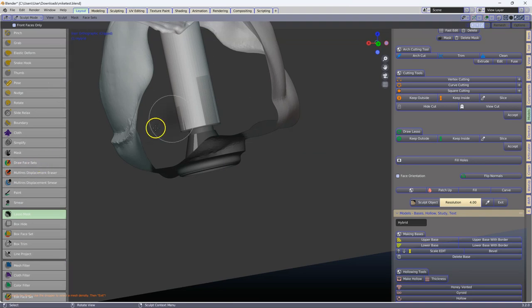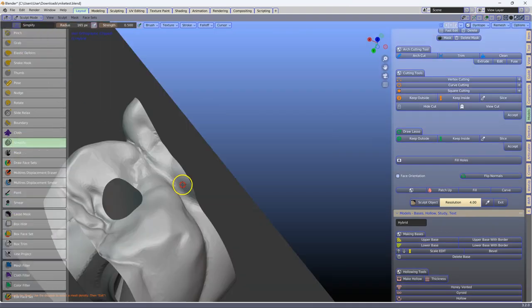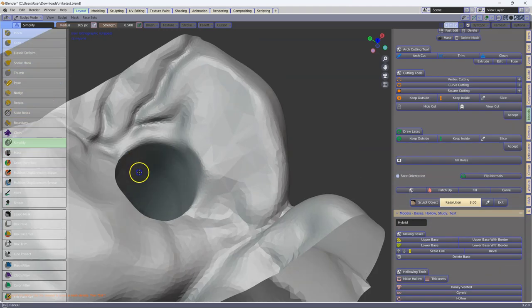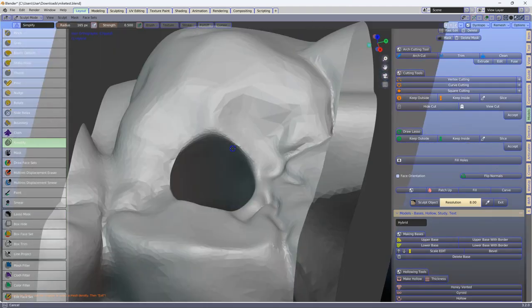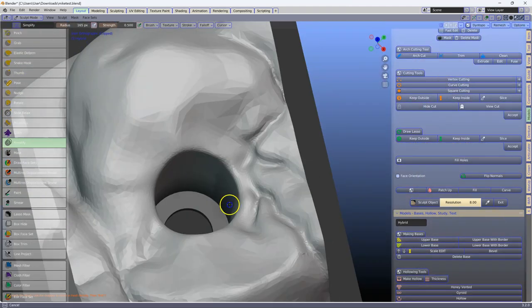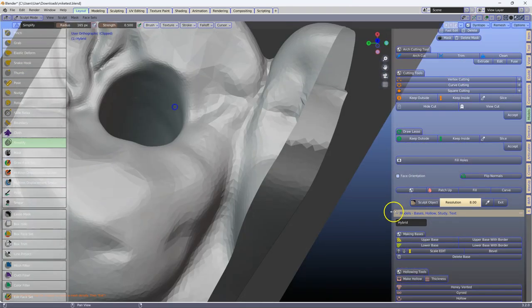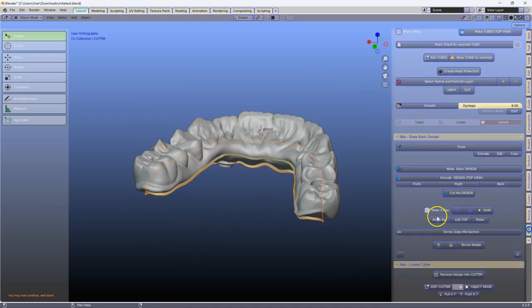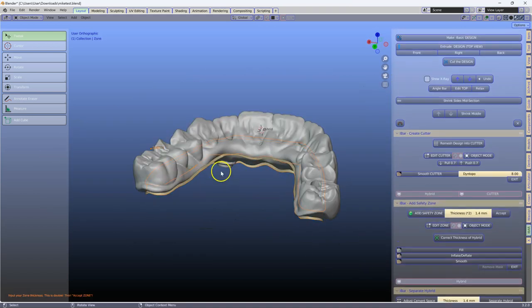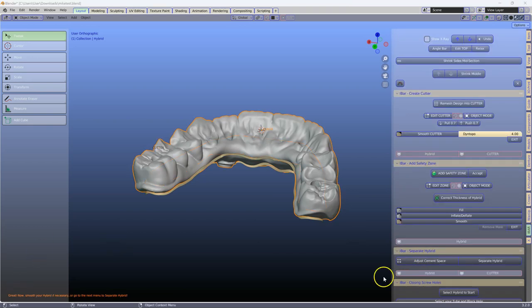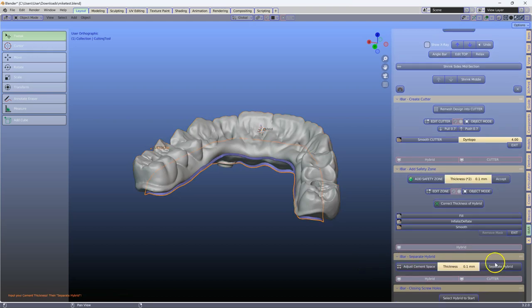Go to the simplify. Go to the adjust cement spacer one more time. And then click on separate.